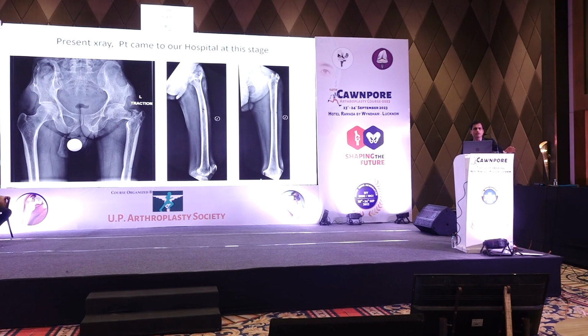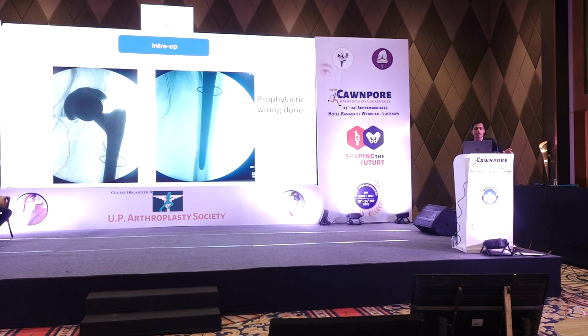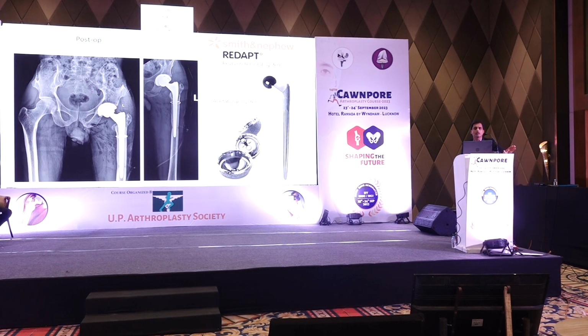A lot of combination, unstable patient, head is already deformed, not much of bone left there. So ultimately the patient needed a distal loading stem and total hip replacement. But the key point here is again uncemented distal loading stem and uncemented cup.